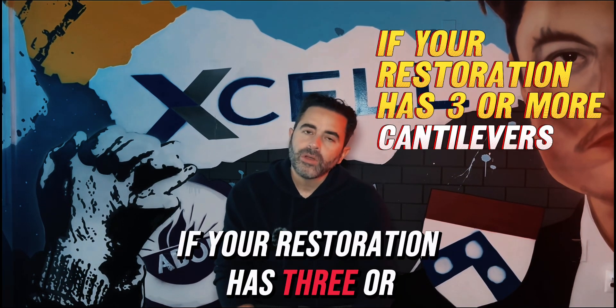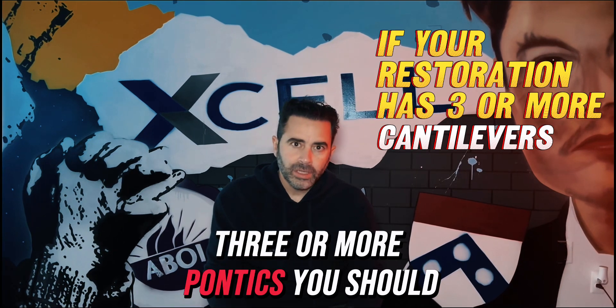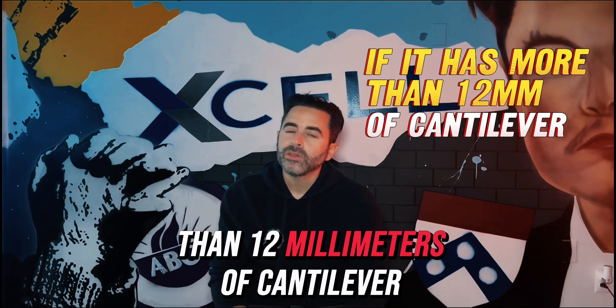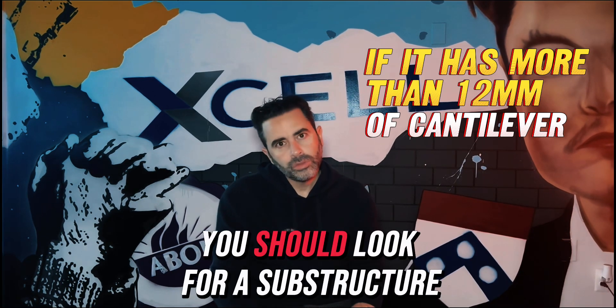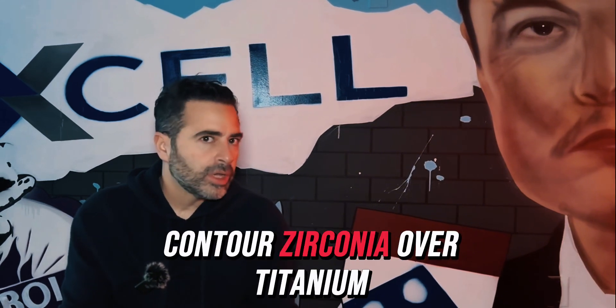If your restoration has three or more pontics, you should look for a substructure. If it has more than 12 millimeters of cantilever, you should look for a substructure. Now, what is the advantage of full contour zirconia over titanium?